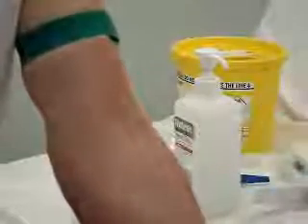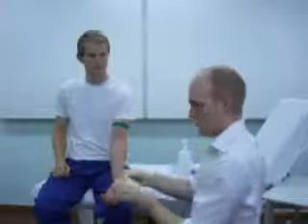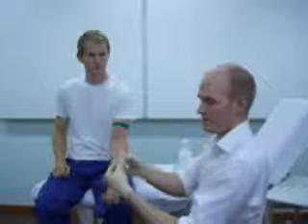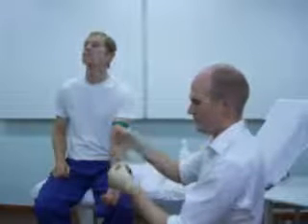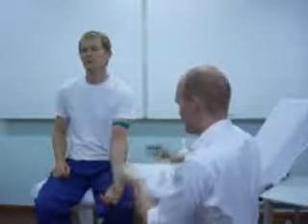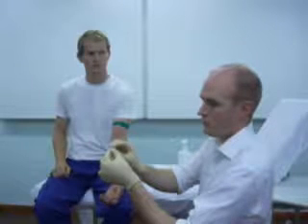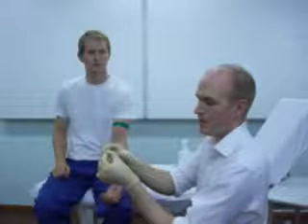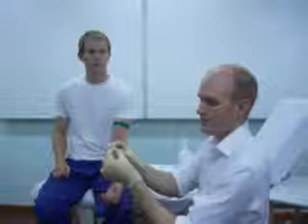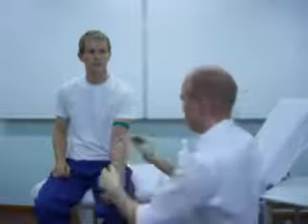Now I've got a clear idea of exactly where I'm going to go. Open the venous cannula, and it comes out like this with the two wings that need to be bent sideways, a protective plastic guard over the top. So take the protective guard off. And the easiest way to hold the cannula is with your middle finger on one of the wings, index finger just around the cap, and thumb behind this supporting structure just here.